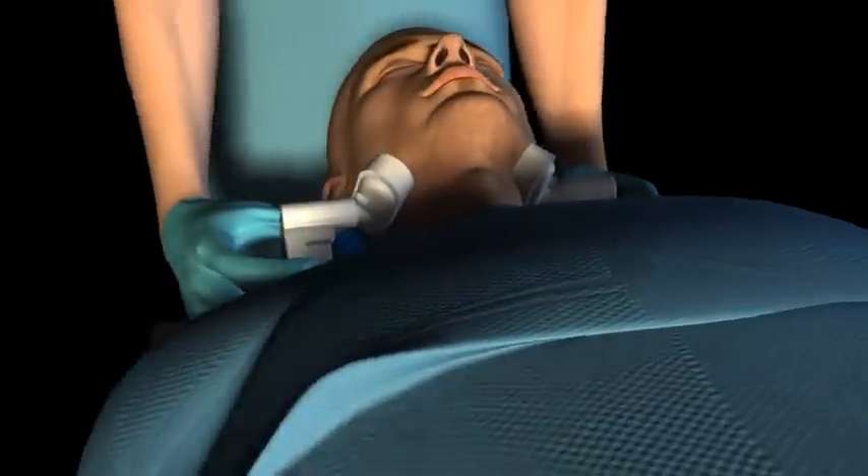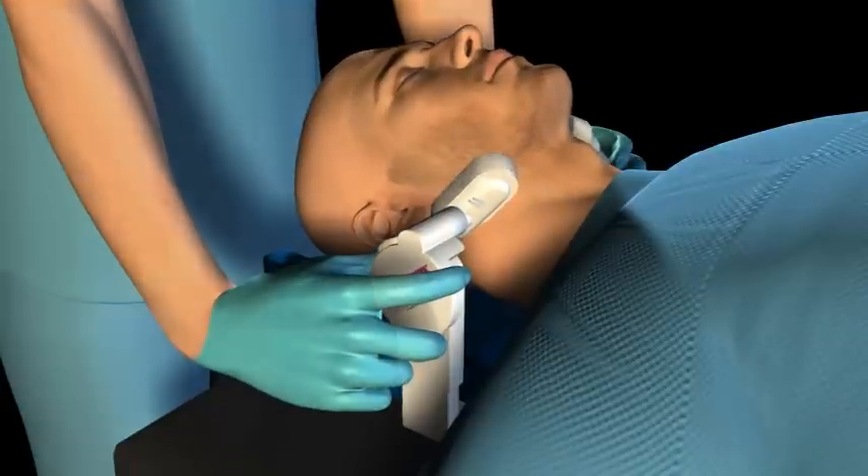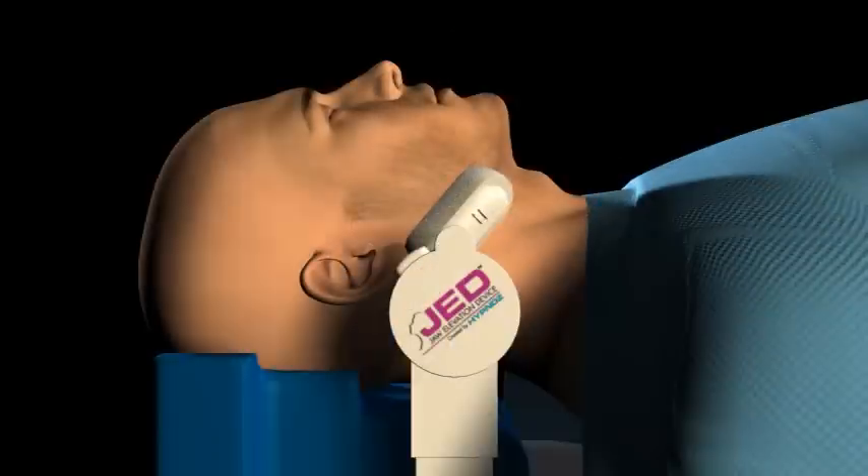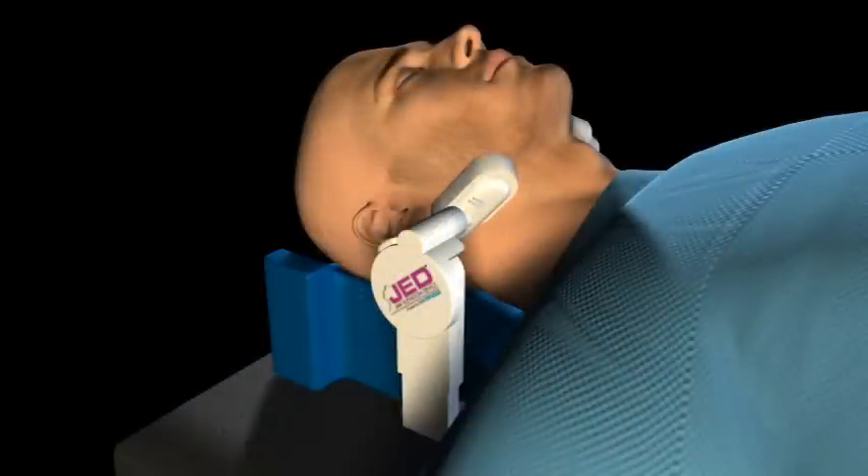Using both hands, turn the left and right rotating knobs backwards simultaneously so that the mandible cups tilt the patient's head back and the airway is open, as evident by chest excursion and/or expired CO2 waveform. To maximally open the airway and dissipate pressure on the mandible, the center of the mandible cups should be against the angle of the mandible. If necessary, adjust the position of the head support or vertical support arms so the mandible cups cradle the angle of the mandibles and the airway is open, as evident by chest excursion, expired CO2 waveform, and absence of stridor or snoring.